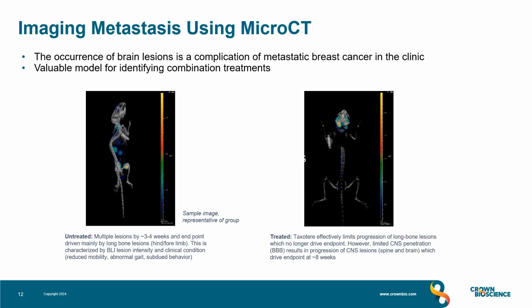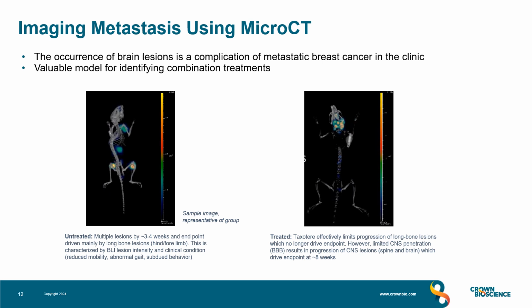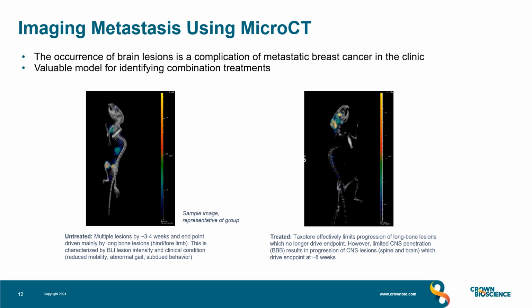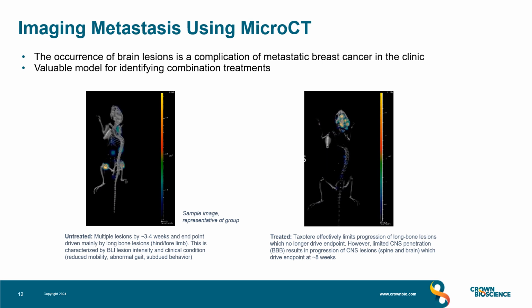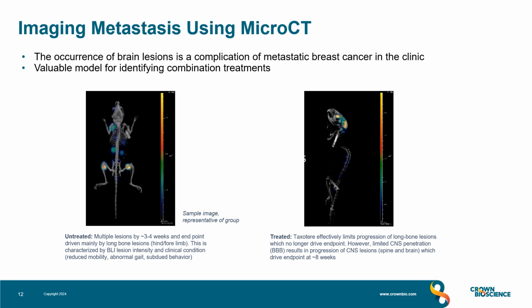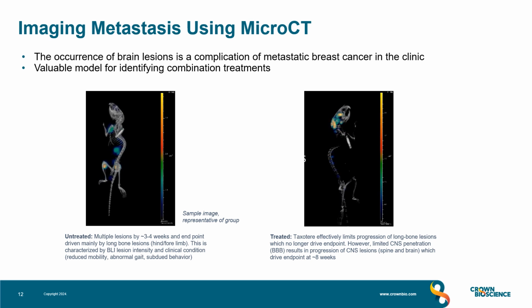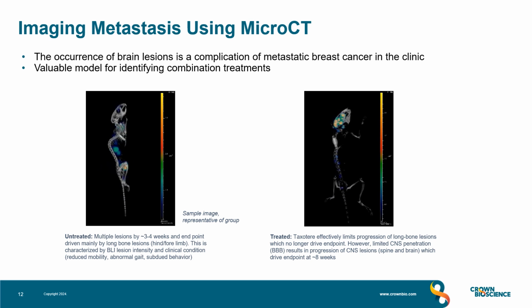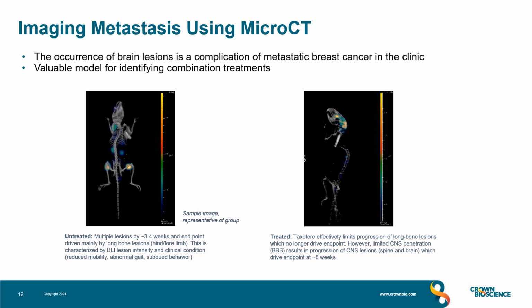This data can also be further characterized using CT imaging approaches. So there's two movies here. The one on the left is showing mice which are vehicle treated. And in this instance, the mice develop metastatic lesions after 3 to 4 weeks, and they reach endpoint due to these lesions.